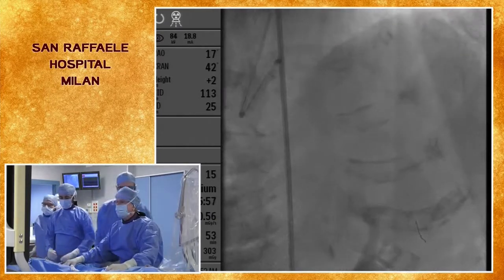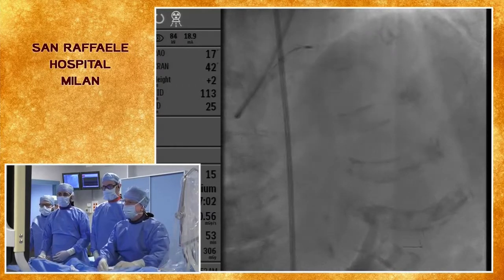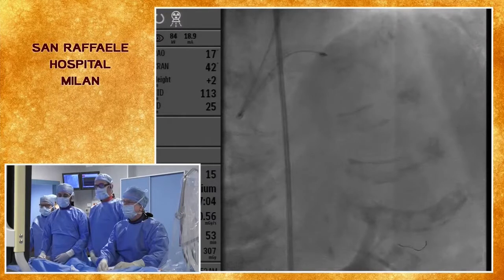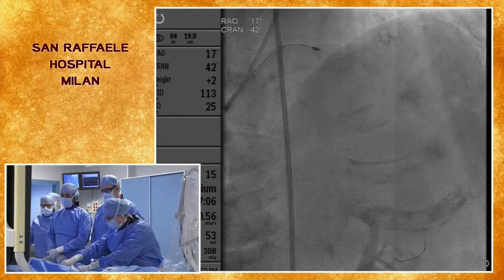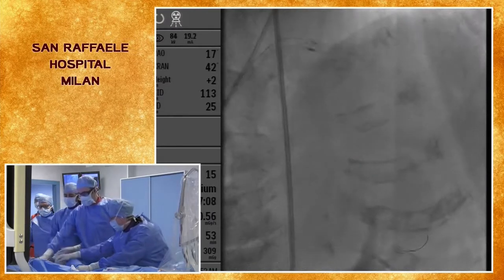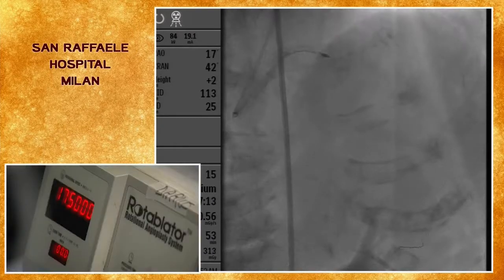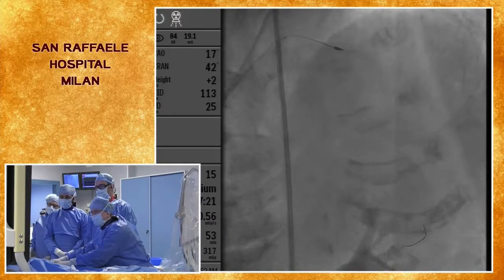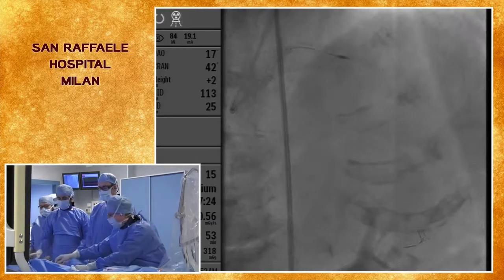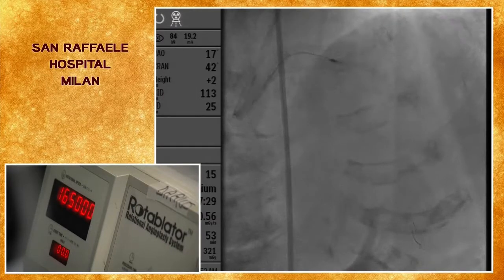Okay, so the rota ablation is now inside the left main. Okay, we are in the proximal LAD, which is fine. Over there is large. We are very tight here. So the brake is on. Let's come back a little bit with the wire. Pull back while I do it. Come back with the wire. Okay, that's fine.